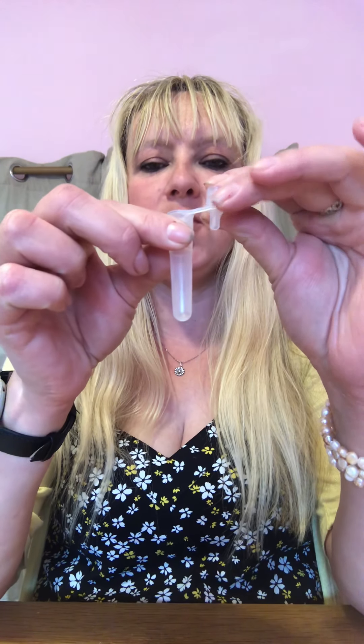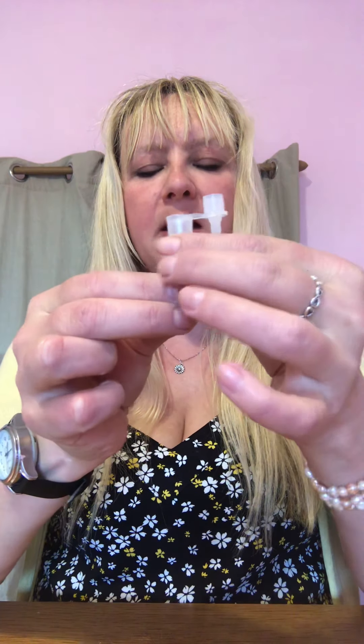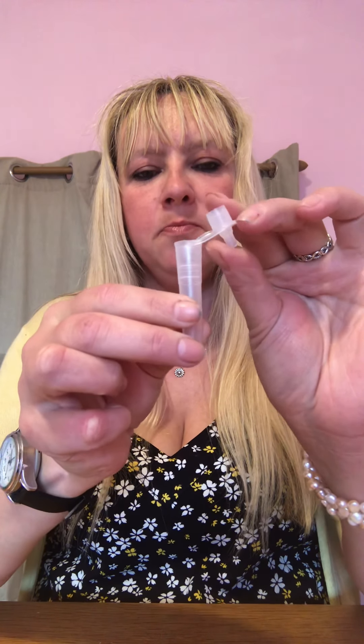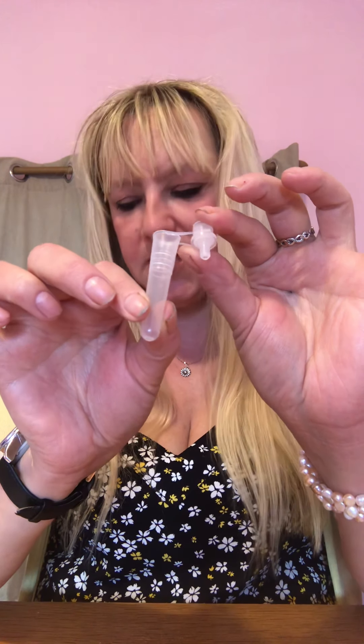Which brings me on to the next piece, also in your test kit — part number two — is the extraction tube itself. It's basically a test tube made of fairly rigid, strong, clear plastic, and it has a lid attached. You need to keep the lid attached. That is your extraction tube, or test tube, whatever you like to call it — part two of the lateral flow test kit.